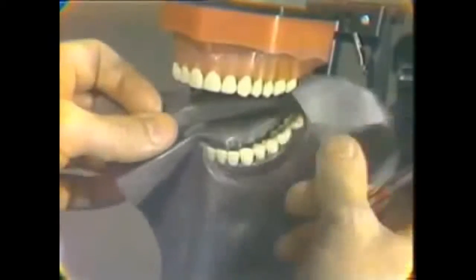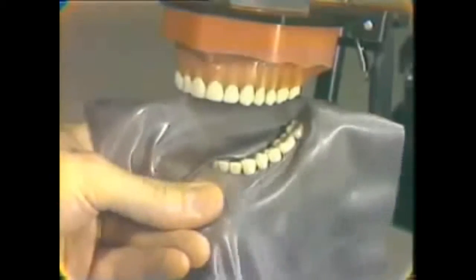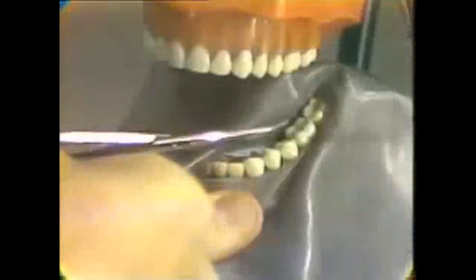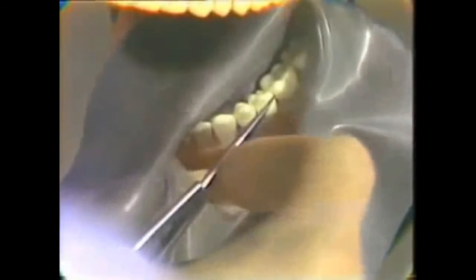Now, using the scissors and stretching the dam away from the teeth and placing the finger underneath the rubber dam, between the rubber dam and the gingival tissue, the scissors are placed to cut the interseptal rubber dam one at a time. The rubber dam is drawn away from the tooth. The tips of the scissors should be visible each time before making the cut to assure that they are not injuring other tissue. And then the rubber dam may be removed.